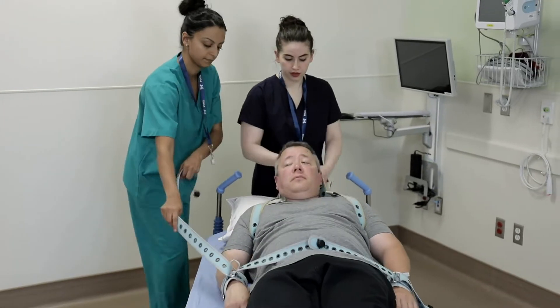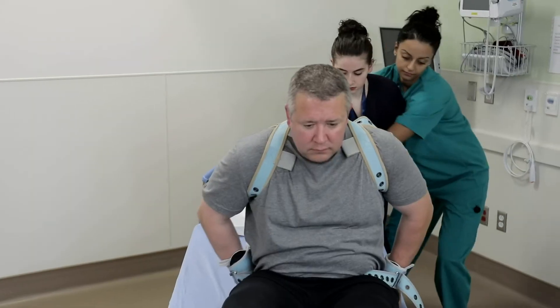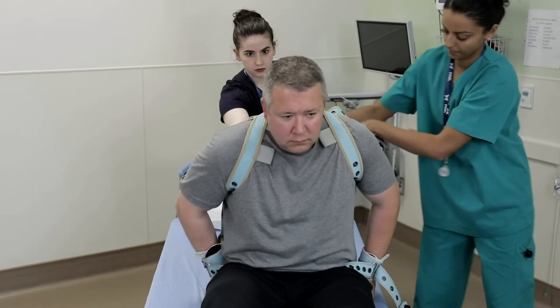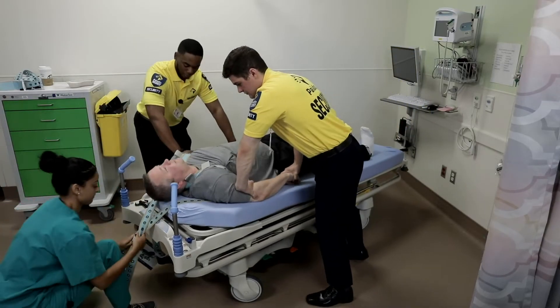During the releasing process, always use the torso control belt for rapid control in case the patient takes advantage of your concessions. Pulling back on the strap will unbalance an attacking patient.